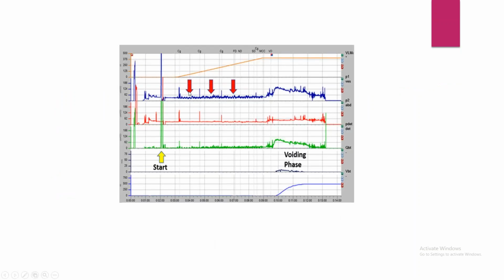So here this is the graph. Can you see this continuous movement of the vesical pressure? Okay, so these are the artifacts, and why has it occurred? Because the pressure catheter and the filling catheter in the bladder have overridden. Okay, and because the saline is moving through this filling catheter, it is causing these pressure changes on this pressure transducer. Got it? So this artifact is because of that. Got it? Yes, ma'am. Yeah.